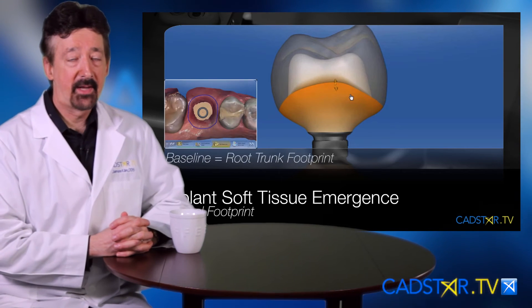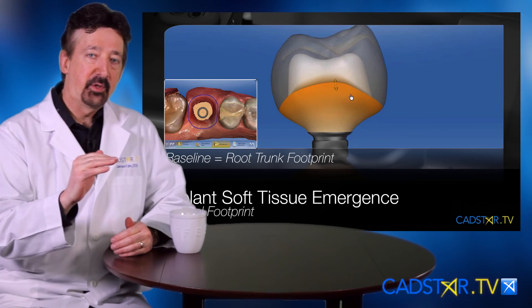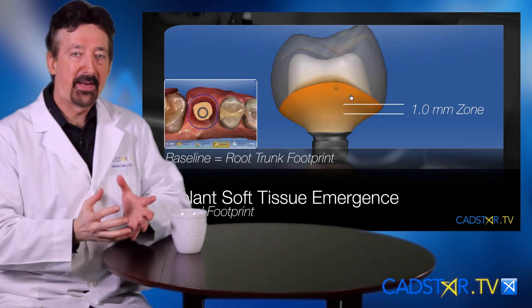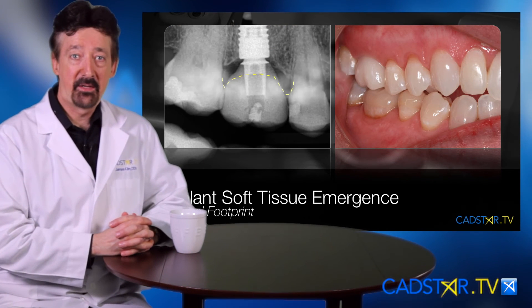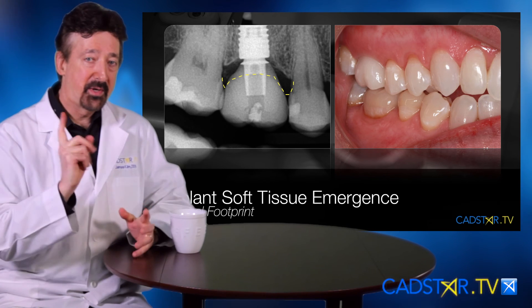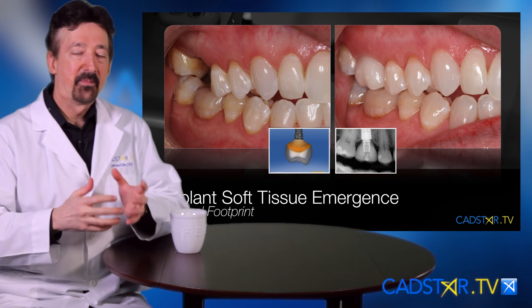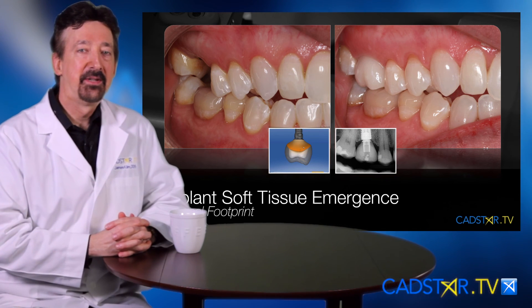When designing an implant, the sub-gingival one-millimeter is critical. Then you feather and taper that down to the implant platform, depending on the size of the implant that you use. So the critical things here are the baseline and the one-millimeter sub-gingival. Let's go ahead and review a few more points on this and illustrations together.